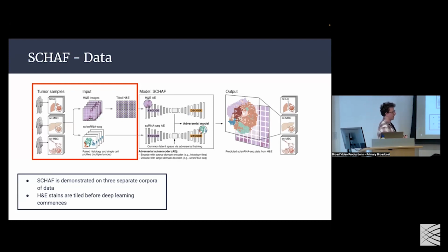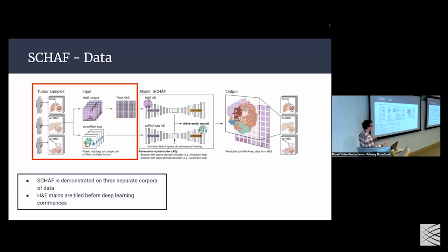We'll consider a corpus, and that corpus will maybe have 12 patients. For each of those patients, we'll have 2 modalities worth of data. You're going to have an H&E stain of a tissue of interest, and then a corresponding single cell data set. So for each of these 12 patients, you'll have a data set of 20,000 single cells' information, then an H&E stain. And you'll have 12 of those, and the objective is to learn a model that will go from the H&E stain to the transcriptomic data.